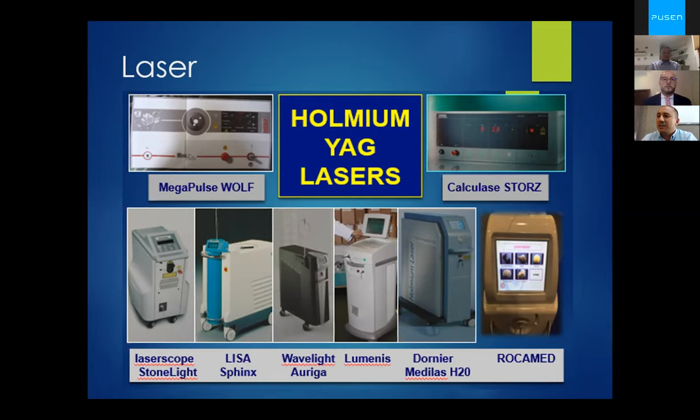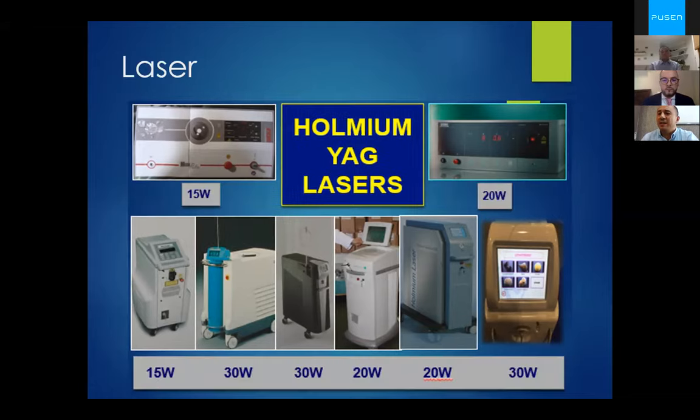This laser is particularly efficient for intracorporeal lithotripsy of all stones, whatever the nature of those stones. This is also perfectly suitable for tissue application: section, coagulation, vaporization of tumors and stenosis. Finally, laser energy cuts different materials such as double J catheters, guide wires, nitinol baskets, so be careful. The power of 10 watts is more than sufficient to process stones.